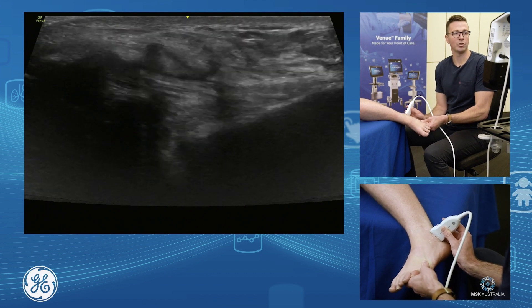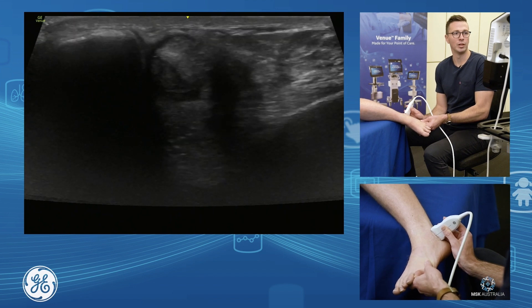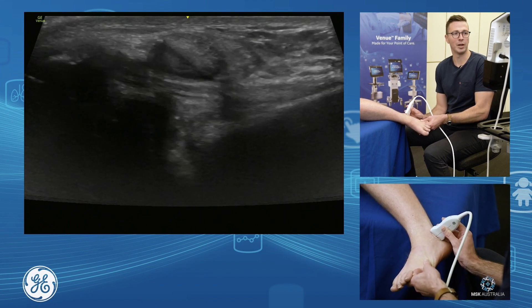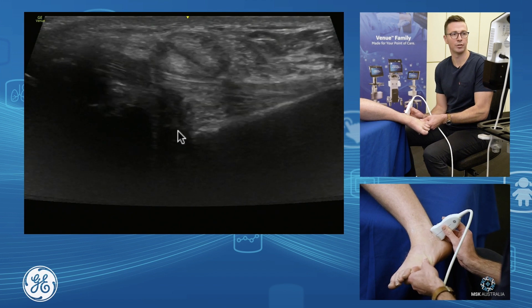When our CFL is intact, it should act kind of as the trampoline to the bottom of your peroneals. It should lift the peroneals up and they should bounce on top of it, with your subtalar joint sitting underneath.